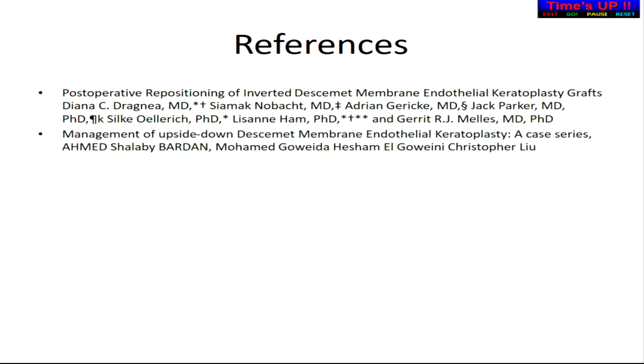Okay, so there you are. We have reviewed all our upside-down DMEKs, and it's being published, and you can see it in a few weeks' time. Thank you.